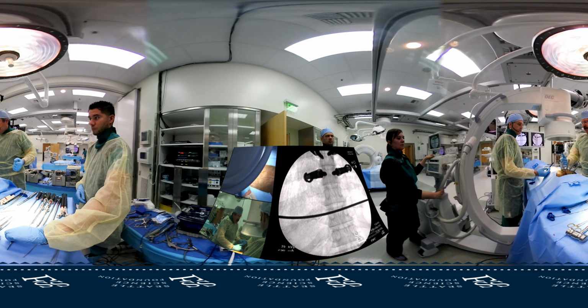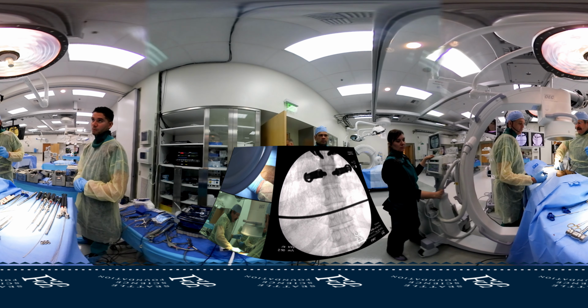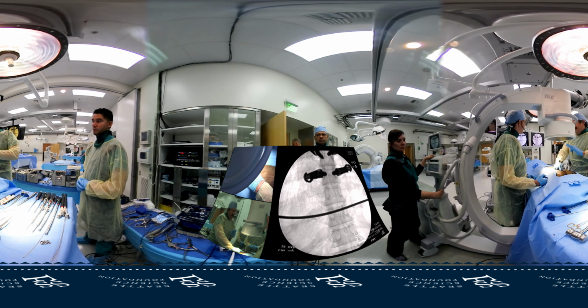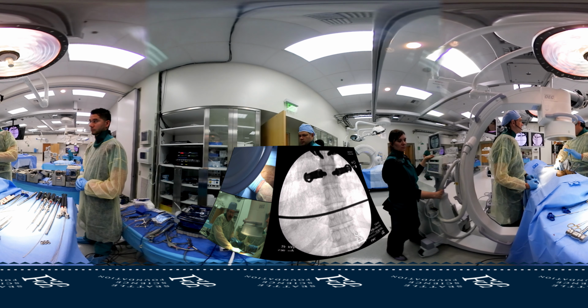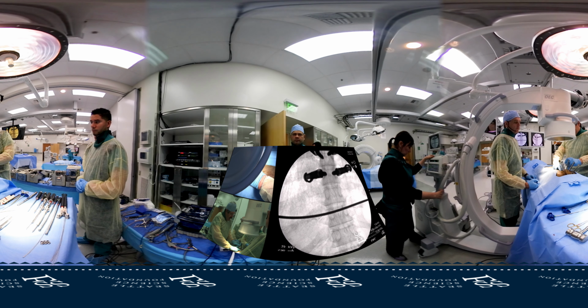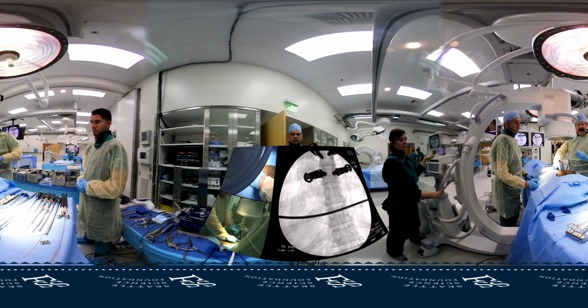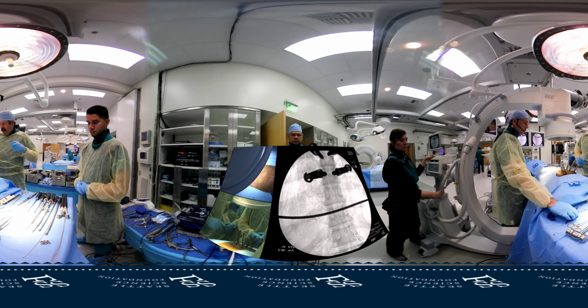Some people will mark it longitudinally, mark their pedicle. I don't do that. For me, I want to minimize my radiation exposure. So I'll get just what I need. So I'll use my fingers. I'll feel the spinous process between my fingers. Usually it's about 2 finger breadths out in the lumbar. We've learned from this patient it's about 1.5 finger breadths out, and I'll make stab holes, just 2 stabs.